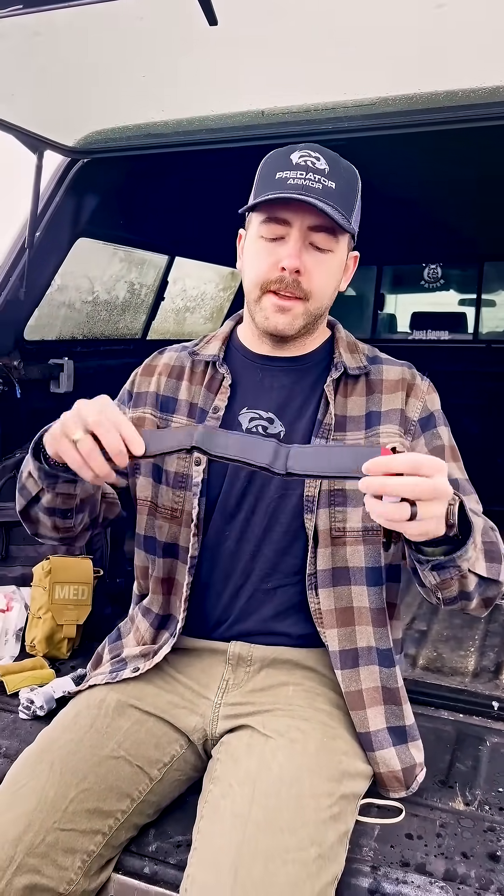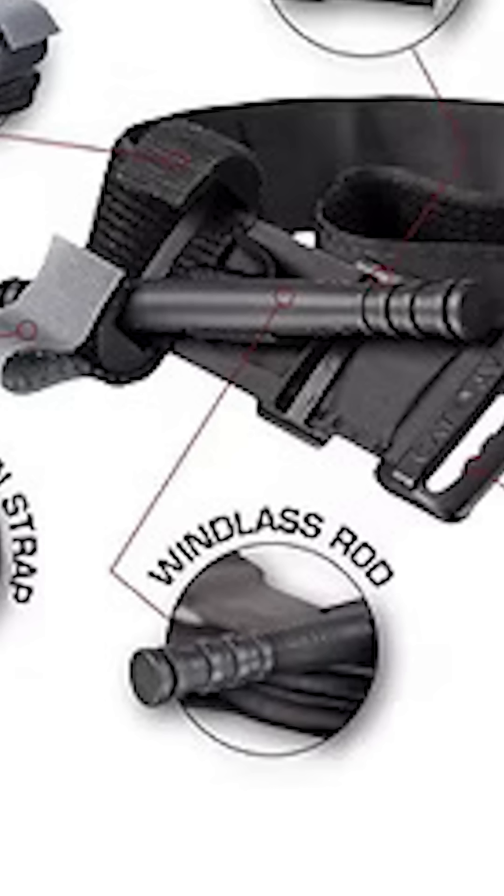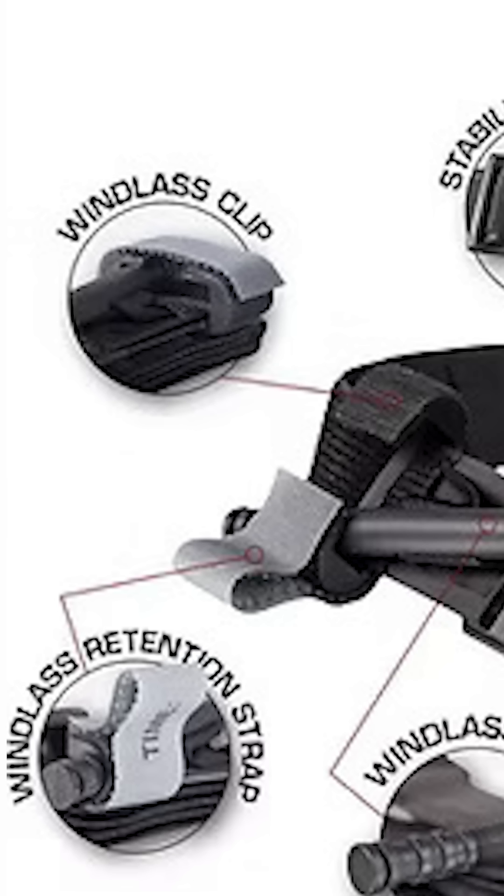We have our tourniquet here. I'm going to go over the parts of it so you understand it a little better. This is the self-adhering strap. This is your windlass strap. This is your windlass rod. And this is your windlass clip.